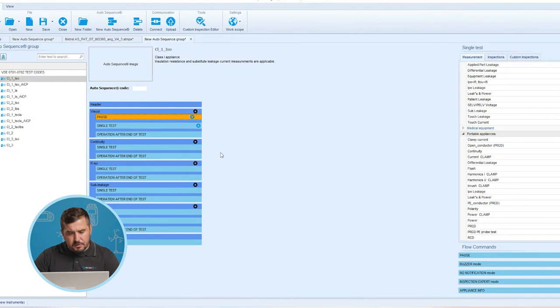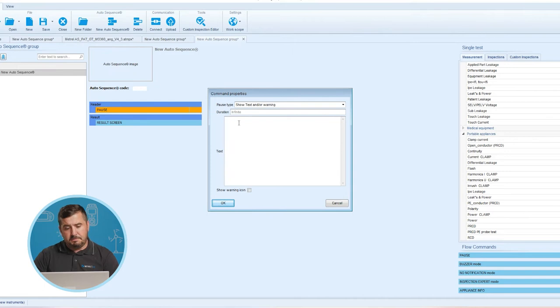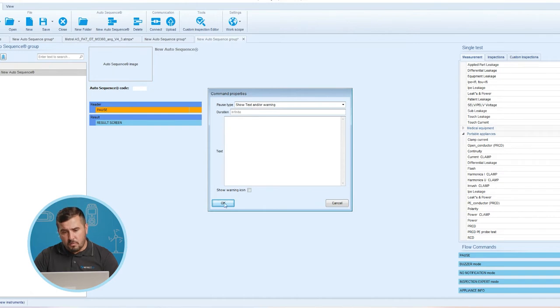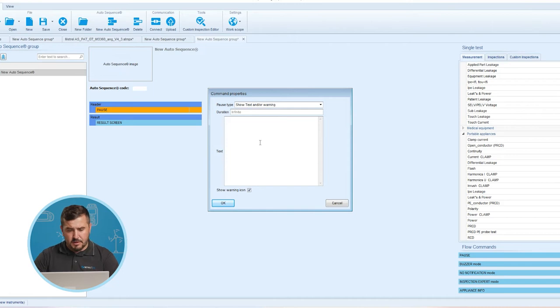Let us now check the rest of the flow commands one by one. For the Flow Command Pause, I will start and create a new test sequence. A pause flow command with text messages or pictures can be inserted anywhere in the measurement steps. A warning icon can also be added to these text messages. Arbitrary text messages can be entered in the prepared text field of the text menu window.